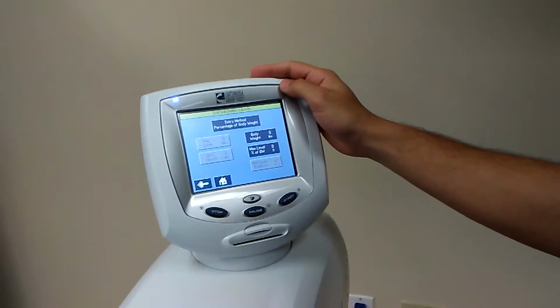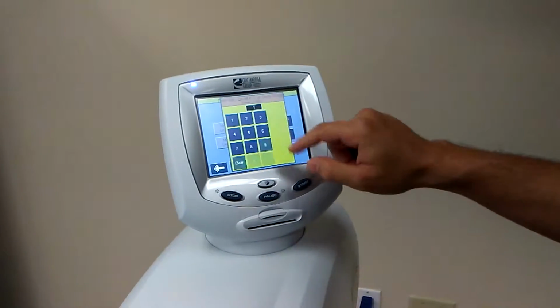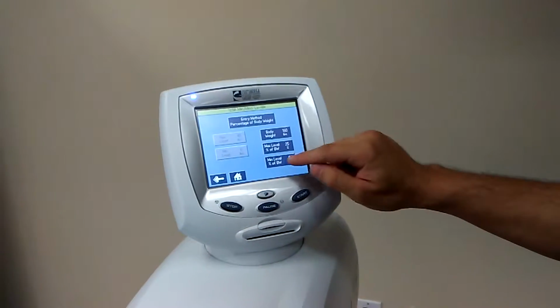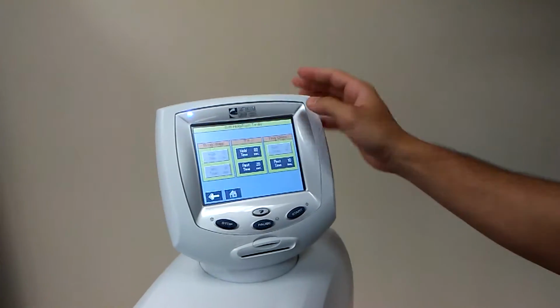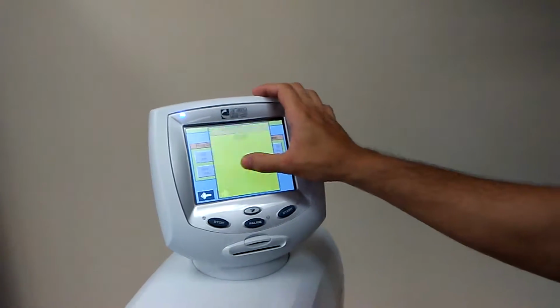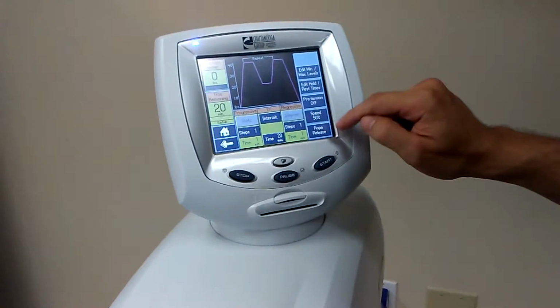Now goes for the force. Patient is 160 pounds. Max body weight will be 25%. Minimum should be 12. Hold time would be 5 seconds on, 5 seconds rest. Speed would be 100%.